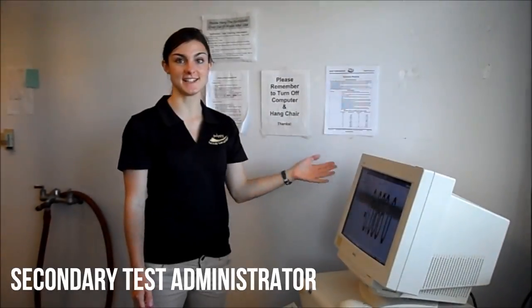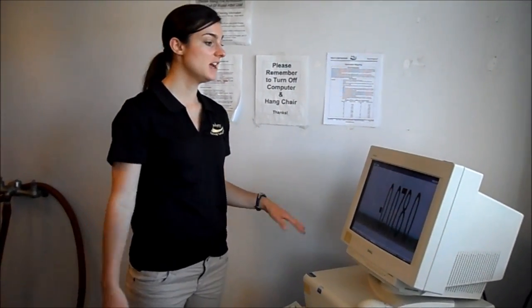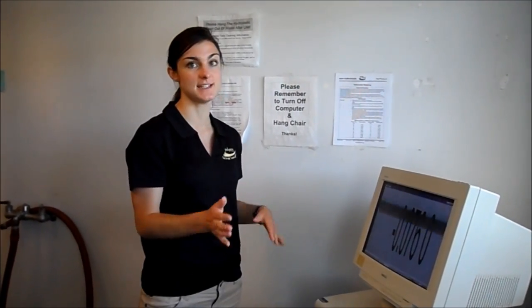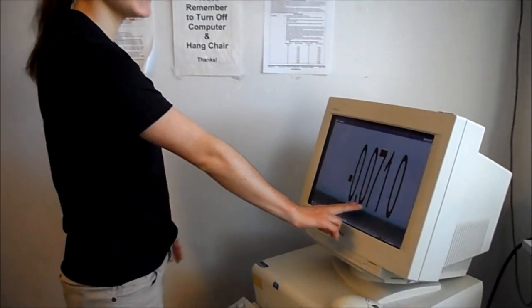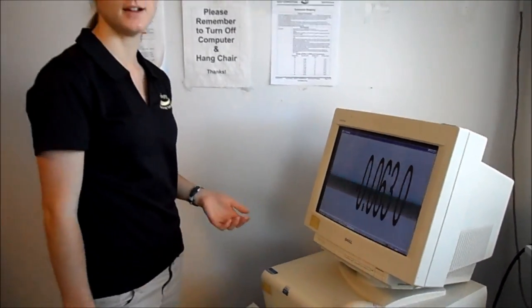This is the computer where the secondary test administrators will take the readings for the hydrostatic tank. I like to have about two people doing the readings because the numbers tend to move slightly fast. One person can read the first two numbers and one person can read the second two numbers, then you just record it on your sheet.